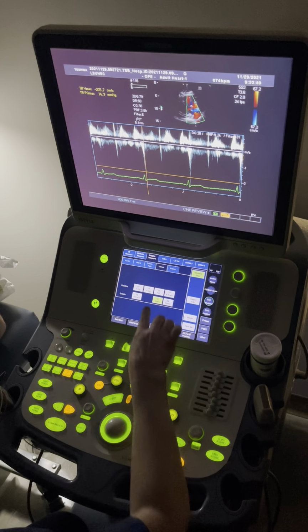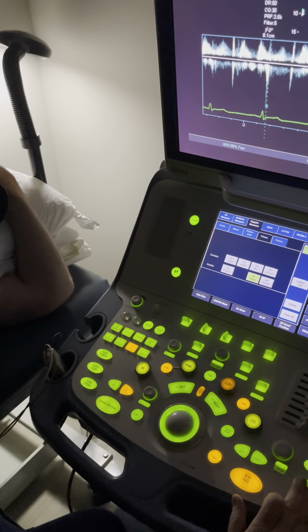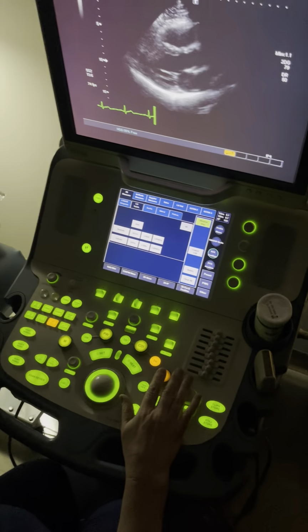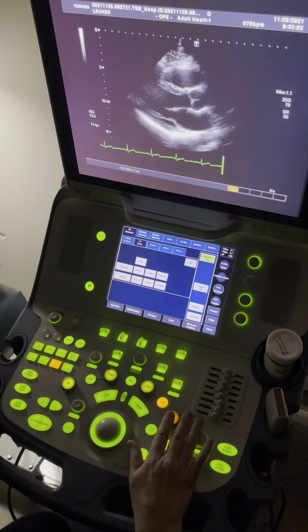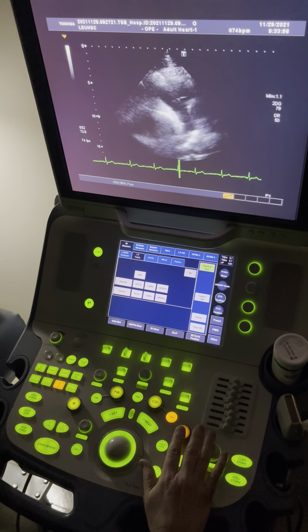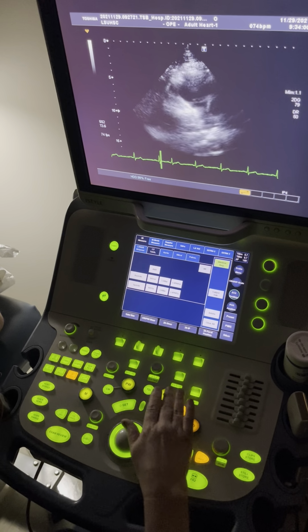I went to tricuspid. I picked TRV max. I'm going to go to the peak and measure it. Is that AFib? No, that's not AFib. 60 cycle interference, but it's not AFib. Then I'm going to rotate or angle the other way, and I'm going to pick up the RV outflow. Very nice. Turn on color.